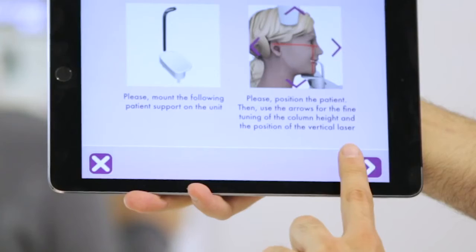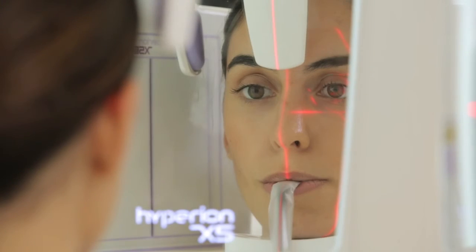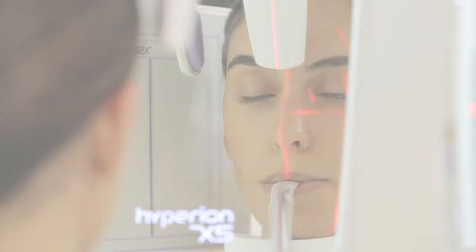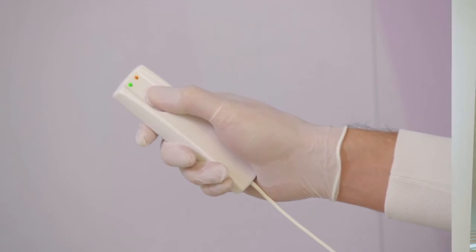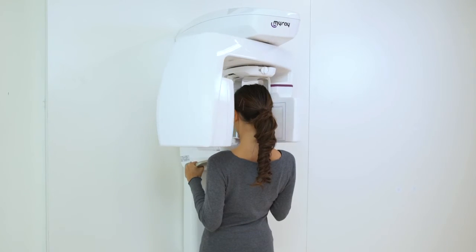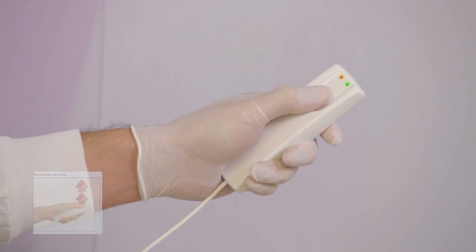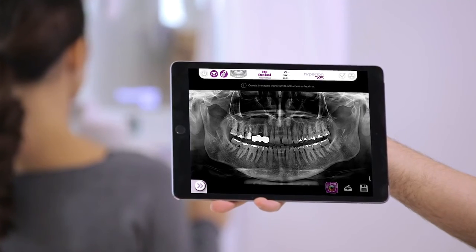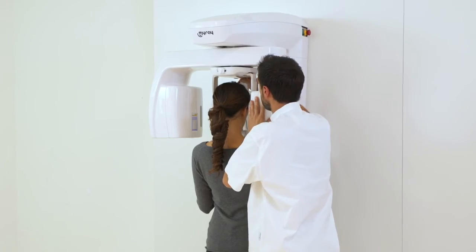Now next is pressed, and before leaving the room, the dentist asks the patient to close her eyes and put her tongue against her palate. After the scan is completed, a message is displayed on the virtual console to inform that the button should be released. A preview of the X-ray image is immediately displayed on the virtual console. The scan has been completed.